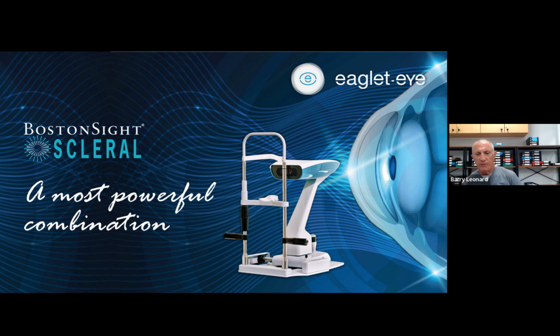And so it's really changed. Once we have this information, in the past, when we didn't have profilometry, the only part of the eye we didn't know anything about, really, was the shape of the sclera. I know the shape of the cornea, I know the shape of the retina, I know all this stuff. I didn't know it. And we do our art, and we all get pretty good at looking and tucking and bending things.